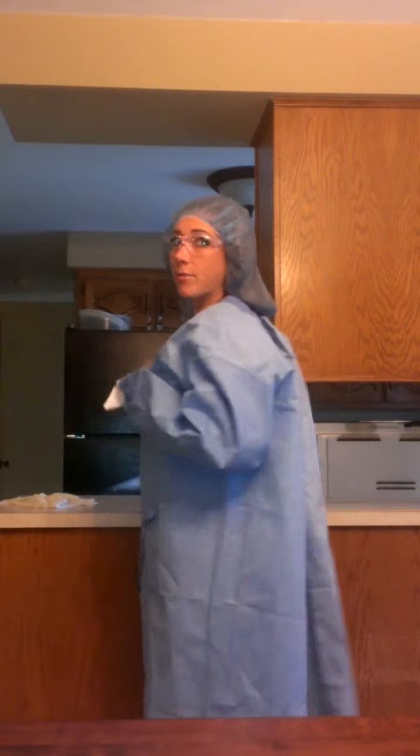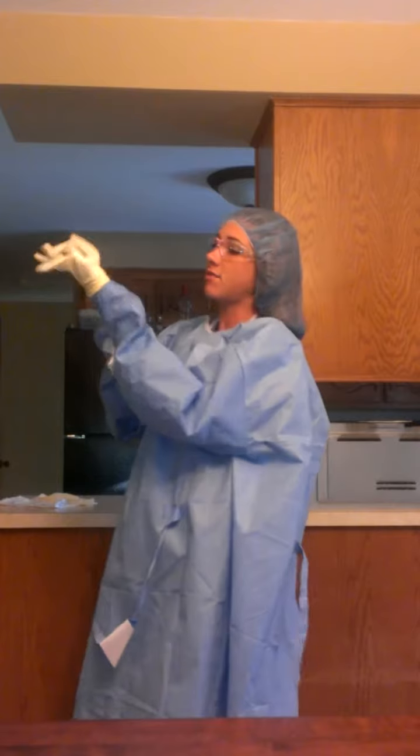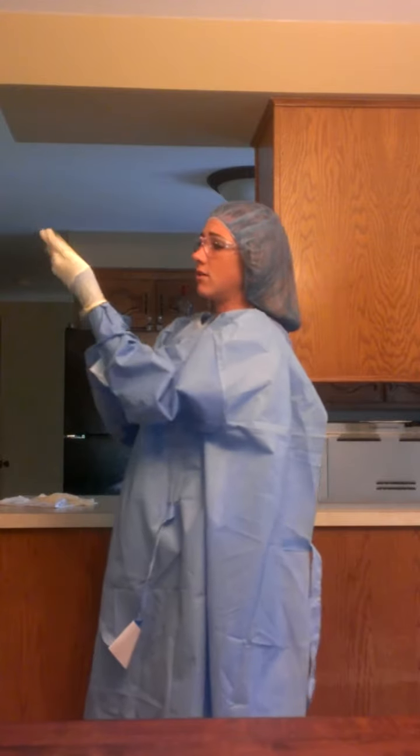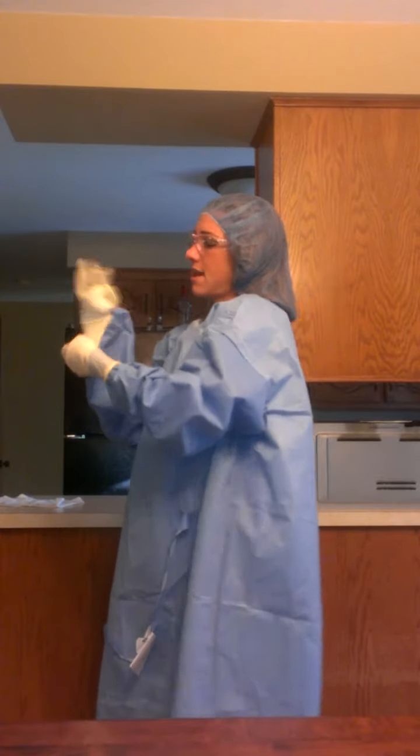Now notice my hands do not come through here. The circulator or the nurse is going to walk by and tie you up here. Again, they are in the non-sterile role, so they can do that. They don't need to wear gloves or anything. So my hands are not through here. There's a specific way that we put on our gloves, like so, and we kind of pull our hands through that way. So while I'm doing this, the nurse has got me all tied up here.